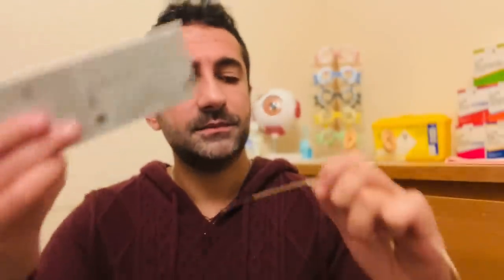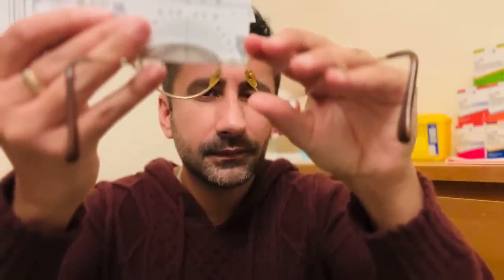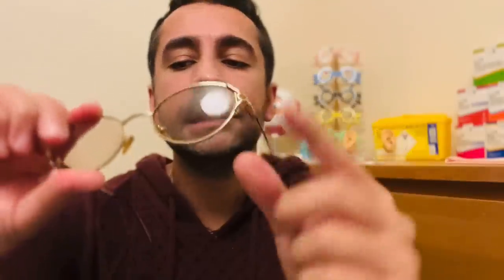Taking the measurements on this frame: length to bend is about 95 on both sides. Bridge is 20 and eye size is 46 millimeters. Did you have adequate protection from the sunlight? Excellent lens quality. Just on the left there are some fine hairline scratches, but otherwise excellent condition. There's a little bit of a squeak, so you may need the joints tightening up.